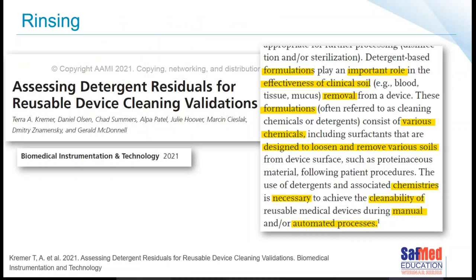Moving on to another important concept, and I want to talk about rinsing. I was doing a site visit. As you know, I often audit CSSDs and try to assist wherever I can in all your practices and in your various designs to help improve your various practices. And in one particular CSSD, I was standing and watching somebody clean some instruments. They cleaned everything and they never rinsed once. So I asked the lady concerned why she wasn't rinsing, and her answer was she didn't have time to rinse. And my thought was, I don't have time to come to this hospital then, because I think that's a little risky. Rinsing is a very important part of what we do.